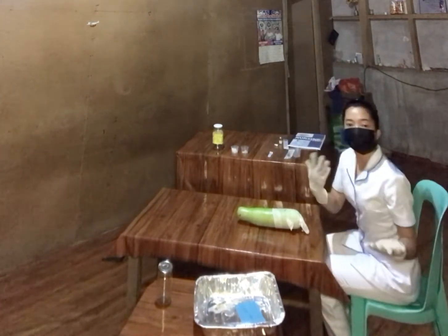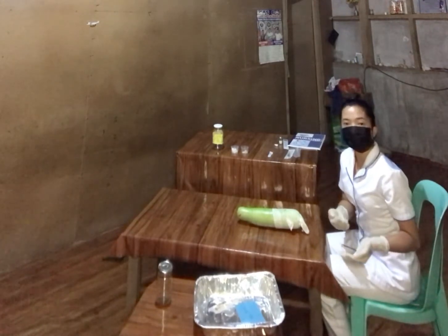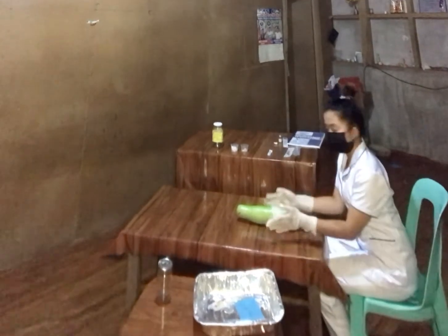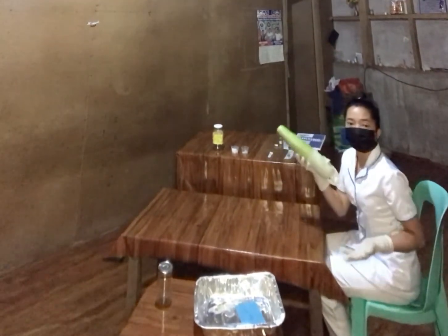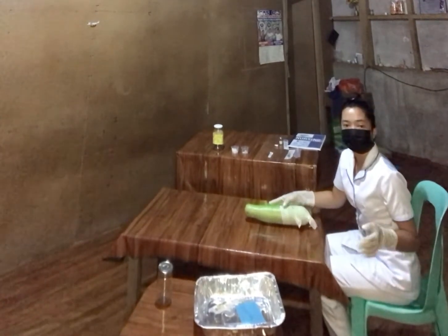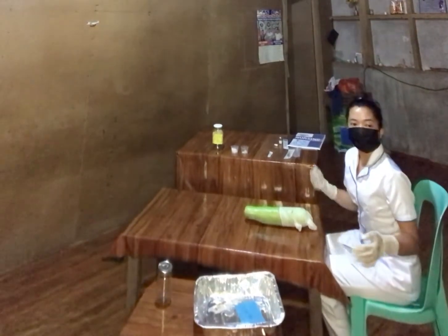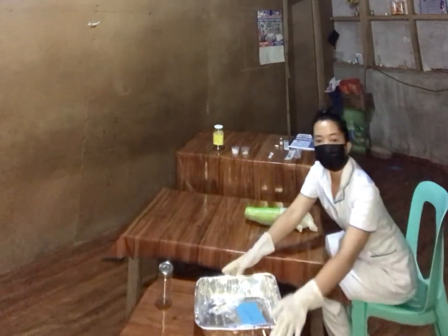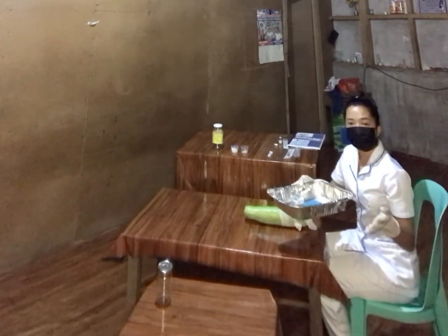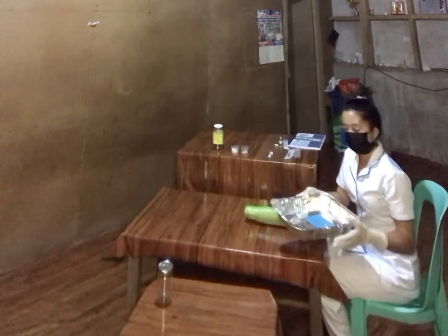Now we're going to perform the injection of the medication from the vial at the intradermal site. We're going to use this one, the vegetable, for administering the medicine. So let's assume that this is an intradermal site of the patient. So first check the medication against the patient chart. So let's compare the vial to the patient chart.